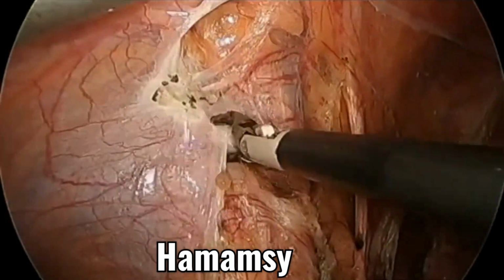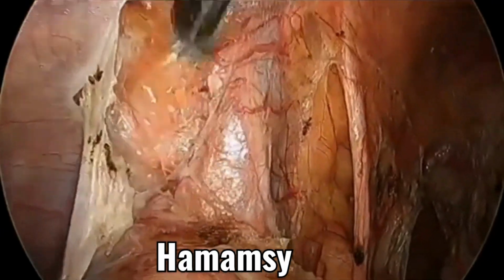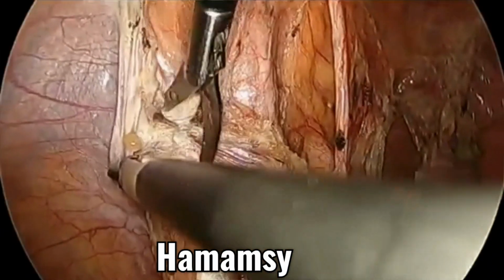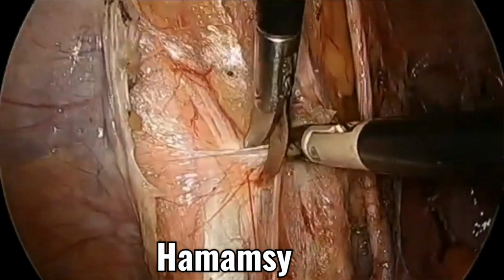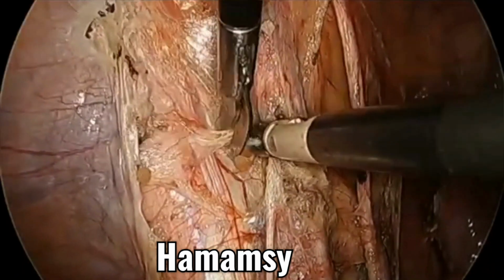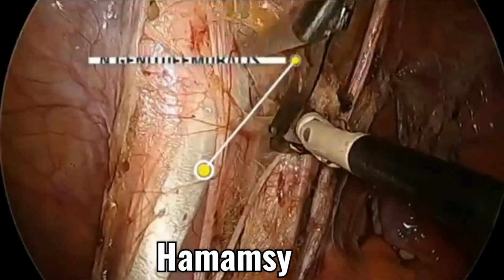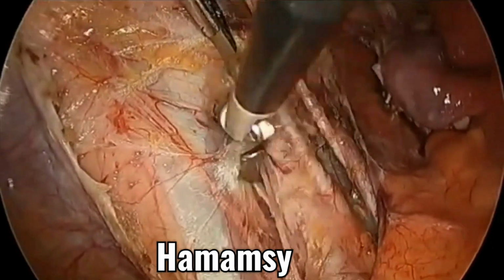3 rules is a very important rule. ان انت بتفولو الرولز دي اثناء الشغل with complete hemostasis زي ما حضرتك شايف. خلاص. اهو. Genitofemoral nerve.